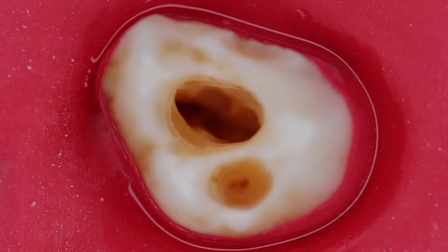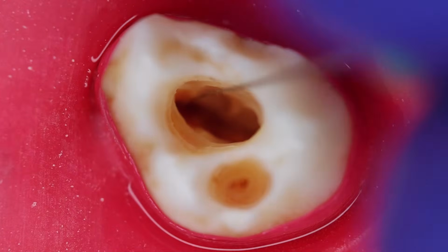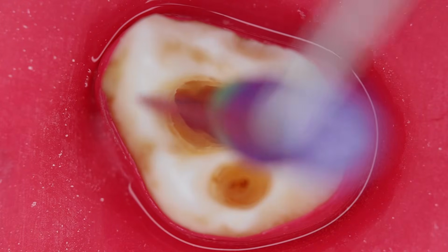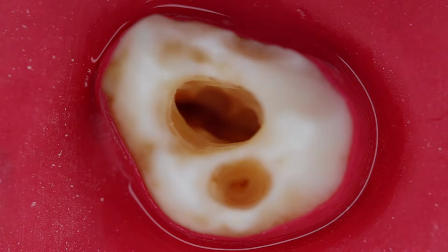Now let us negotiate these canals. We used a reamer to negotiate these canals. We inserted the reamer, this is a 10K reamer. See the direction of this. This is going straight along the mesobuccal cusp tip. So this is the mesobuccal canal. We have not yet taken the working length. Now let us explore the distobuccal canal.